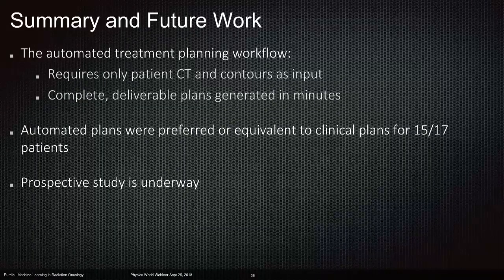And so had we developed a model for, say, in this example, an entire model for patients with double hip prosthetics, then we could have used it. We just didn't have a model available to us. But I think that is actually where there's still a lot of benefit for people who have clinical domain knowledge to be able to say that these things are different and they are impacting the dose distribution or not.